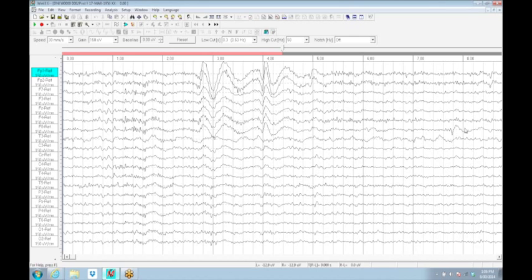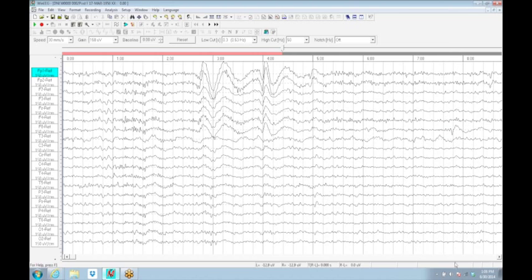Obviously, this is a very good non-60 hertz recording. It does have some electrode issues. You can see the T3 is a little bit unstable. The F8 has a small electrode pop here with no field surrounding it, so it's just the electrode. You can see the eye movements.